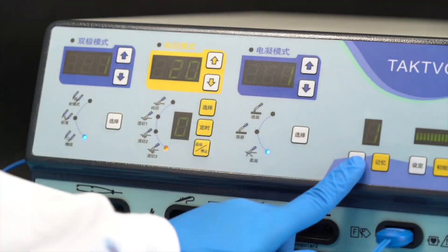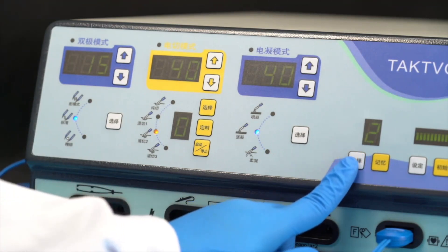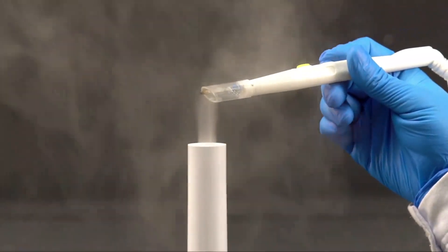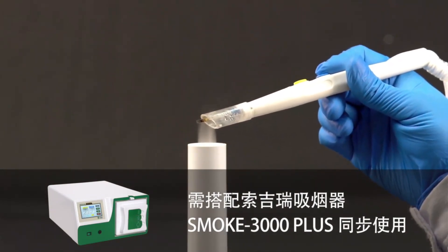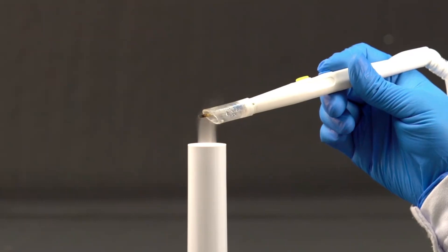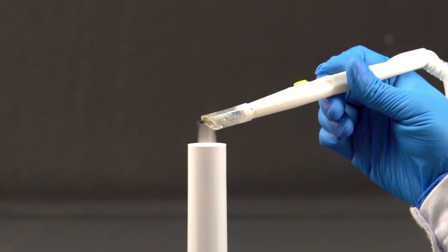The device also has a powerful user memory storage function with nine built-in memory units, which can store the doctor's operating habits under different modes or different operations and quickly switch or recall them during the operation. The TactFall S300D also has extremely powerful expandability — when used at the same time with the TactFall smoking device Smoke 3000 Plus, it can easily realize the smoking function and the smoke produced during the operation can be discharged automatically, quickly, and safely.